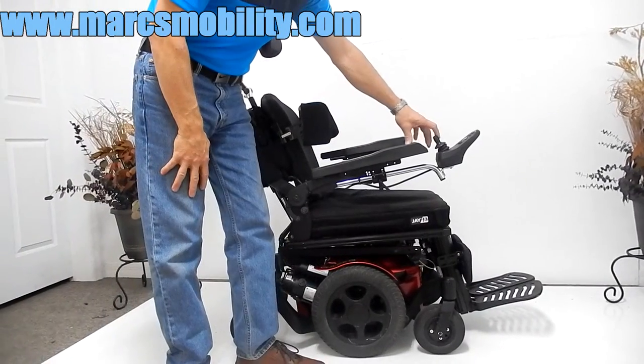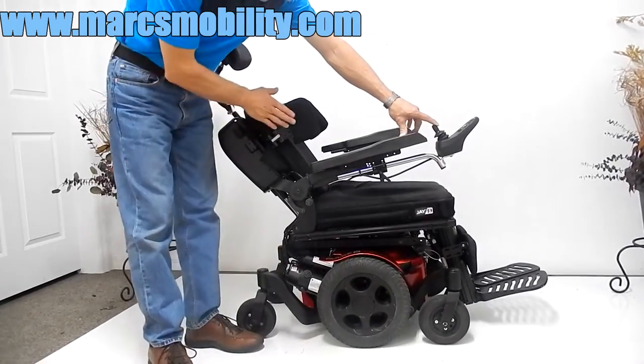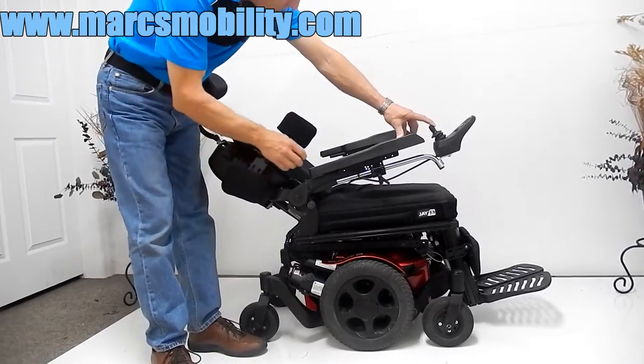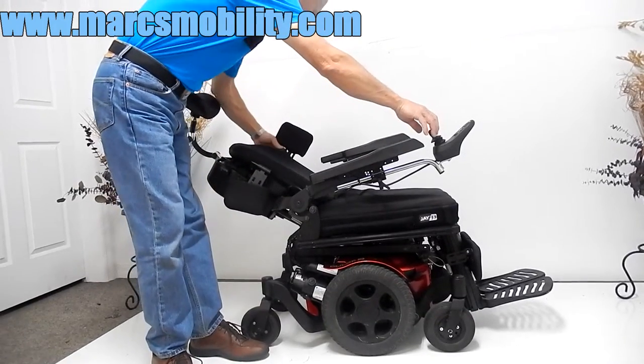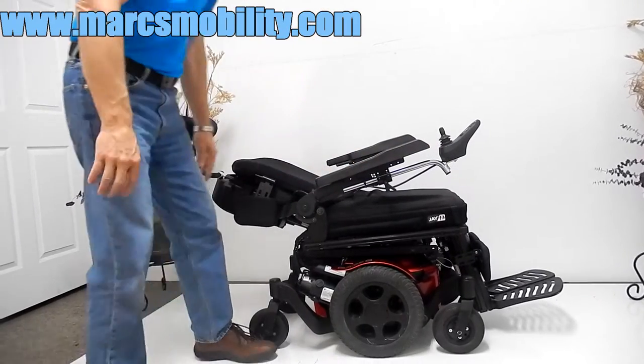Now the electric recline — so this would be your electric recline. This chair also has lateral guards that you can pull out of the way if you want, on both sides. This is your electric recline.